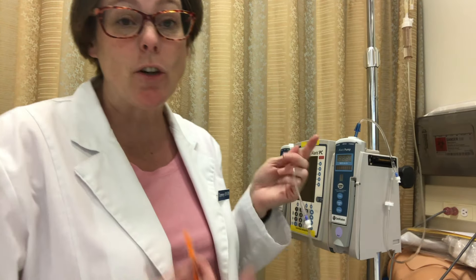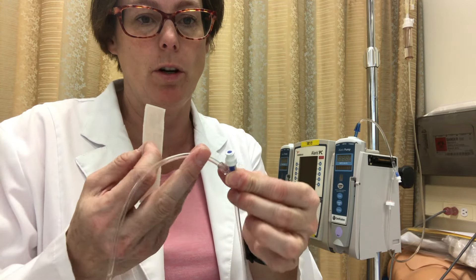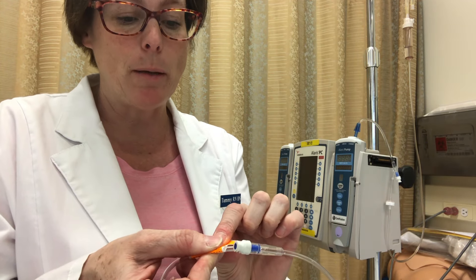Now that your IV line is already in the pump, we need to make sure that it's labeled. At this lowest Y connector, just before it joins, you want to have your tag, and it needs to have the date and time as well as the solution that's in there. The reason we put it at the entry to this port is so that if someone is going to Y in another medication, it helps them to identify compatibility issues.